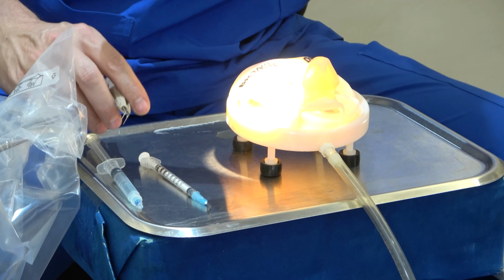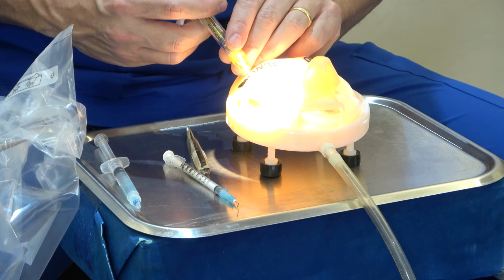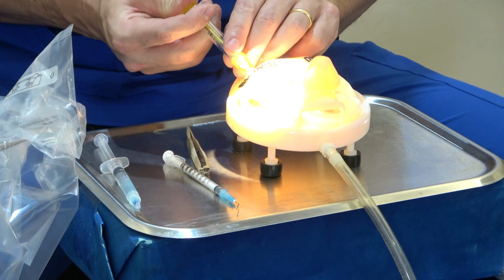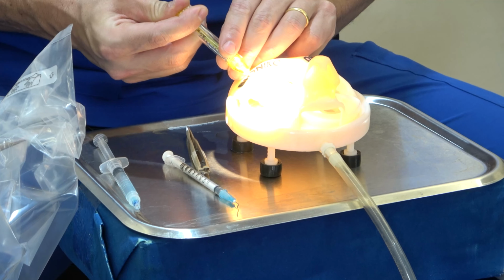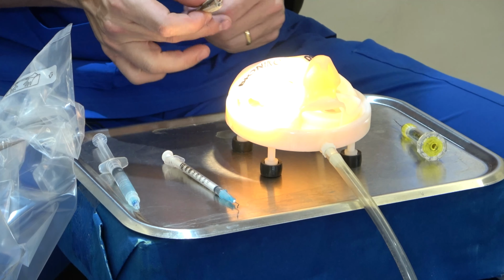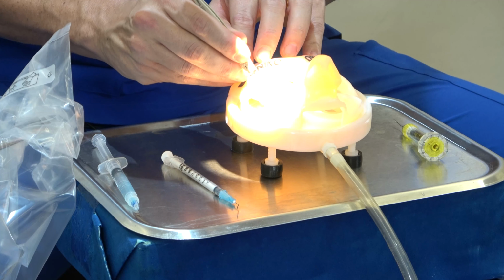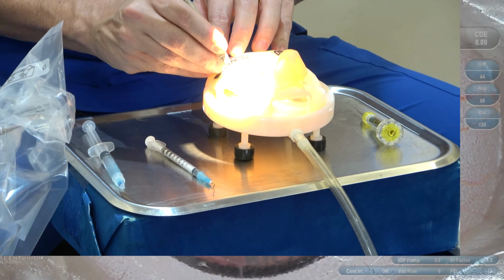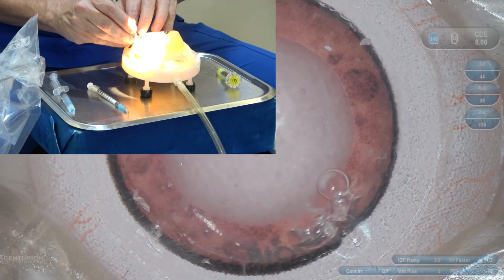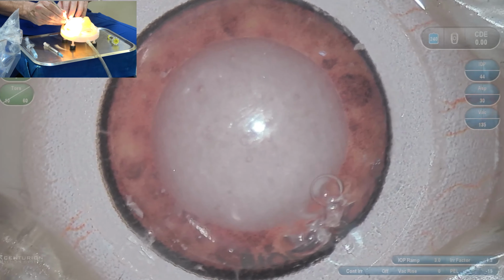Let's put some more viscoelastic. It's going to be a white cataract that is going to behave as a very, very, very hard cataract. There you go. Visualization is very important at all times, but in this case, we really want to focus on the phacodynamics to do sculpting and the quadrant removal.